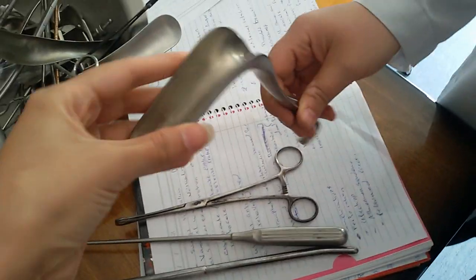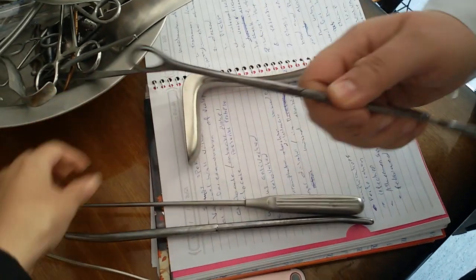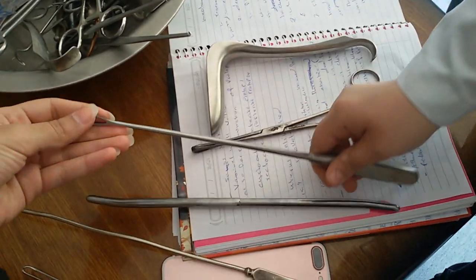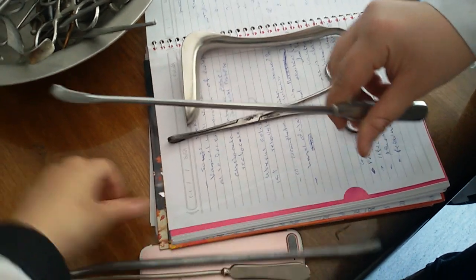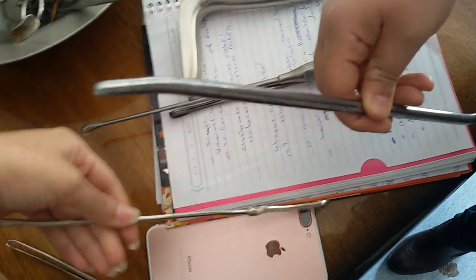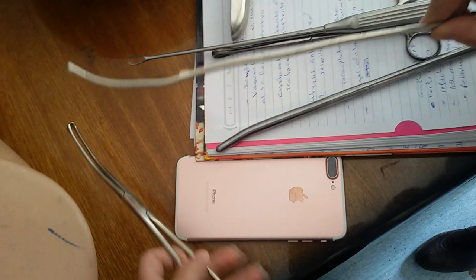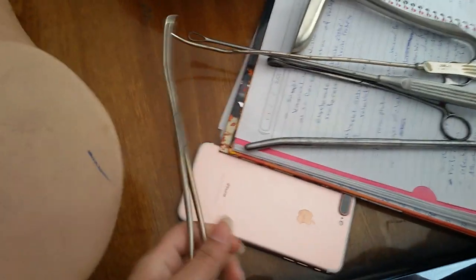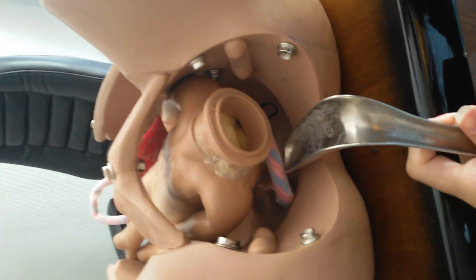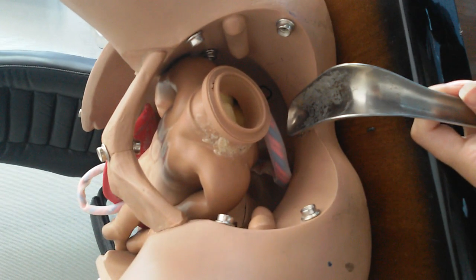This is a speculum, this is sponge forceps, this is a curette, and this is a sound. First of all, after putting the patient on IV fluids and blood and doing simple anesthesia, we use the speculum.